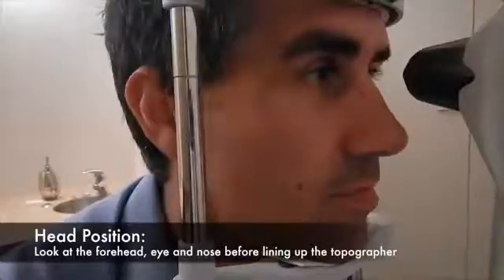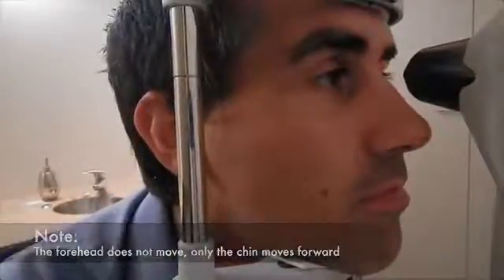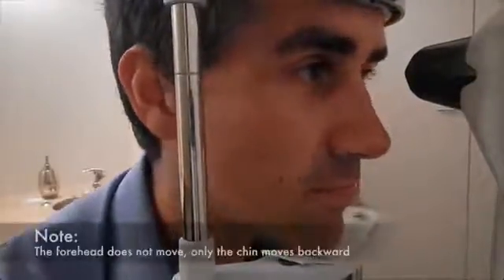Some patients will require a head adjustment of the chin and forehead. As depicted here, this could be forward, or backwards.